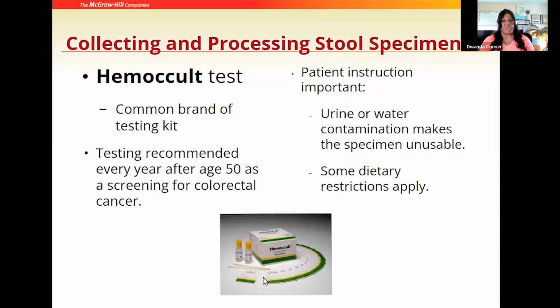Now, with that stool, we're going to take these cards. This is a two-sided card here, and we'll be able to take what's called a really thin smear. So using the spatula here and opening this card, there will be two squares on the card. We're going to apply two very thin smears to the card in each of those boxes. It also comes with a test solution.